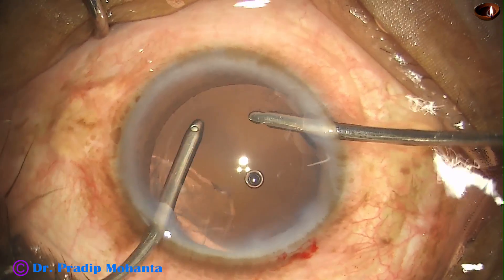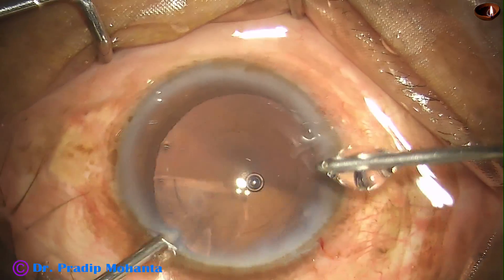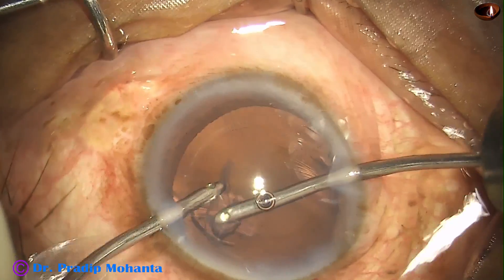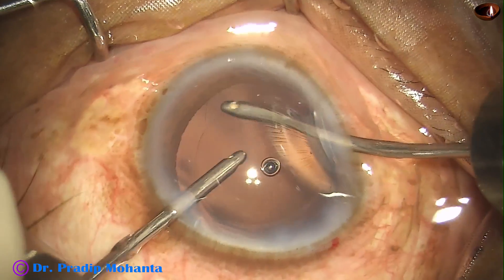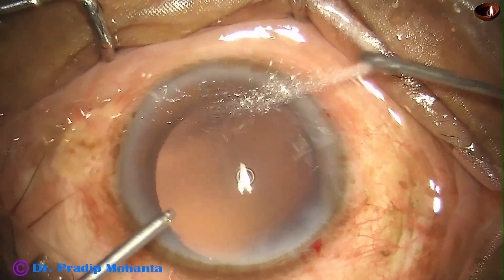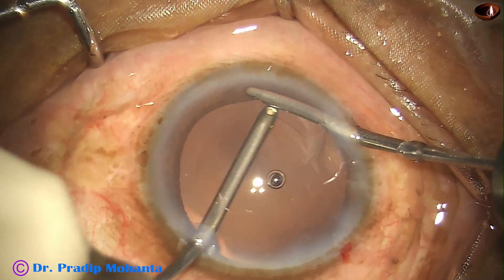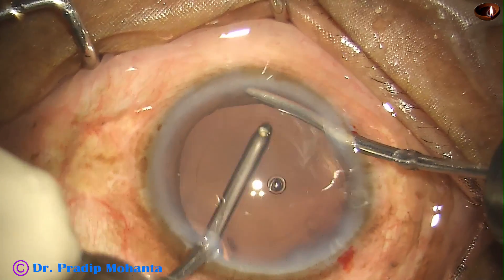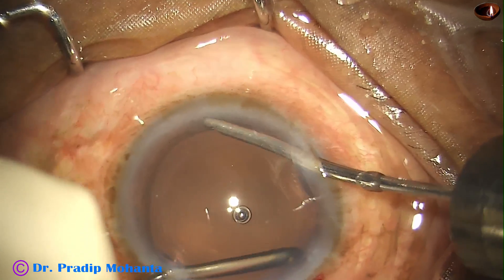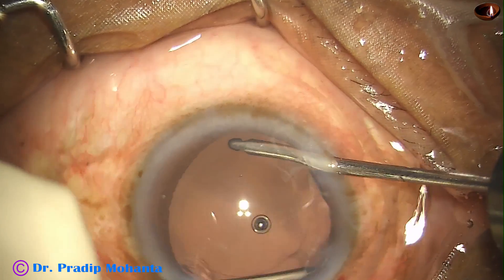But we should also give Simcoe cannula a place in our practice. In some situations, Simcoe is more user friendly. This is irrigation from the left and aspiration from the right at this moment. And this coaxial illumination is such that you can see the small fine details — you can see the lens fibers and you tend to clean them off. In microscopes where there is no coaxial illumination, these lens fibers may be overlooked.